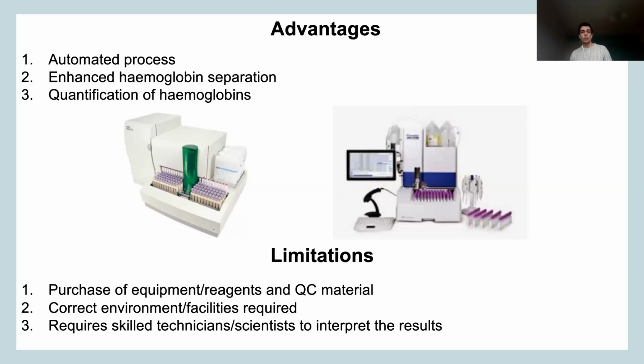It gives you a lot of data, but the chromatography actually needs to be looked at quite carefully, and that is acquired over time, over experience. So it is required that when looking at the chromatography, especially even in our setting, when we have a new scientist being trained, we go through a rigorous period of training, because it takes a while to understand chromatography, the results itself, and especially picking up the little details that actually have quite big significance.